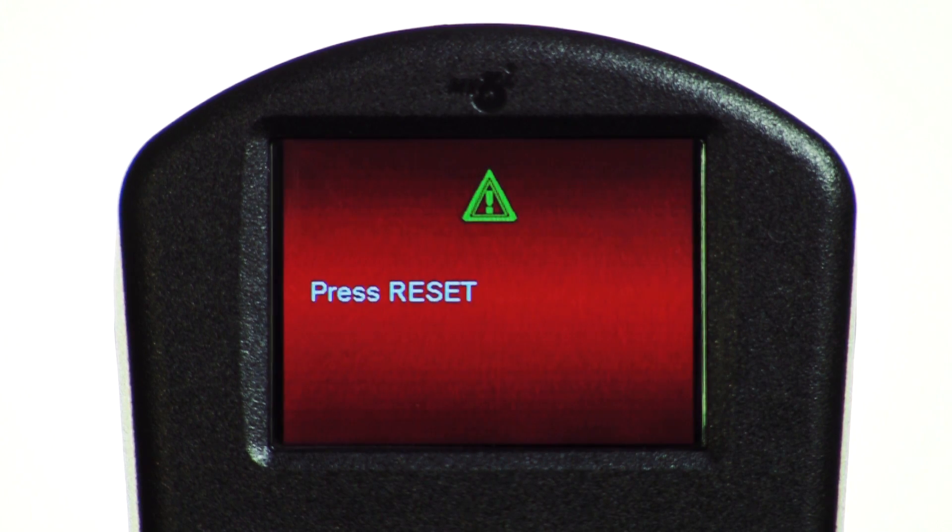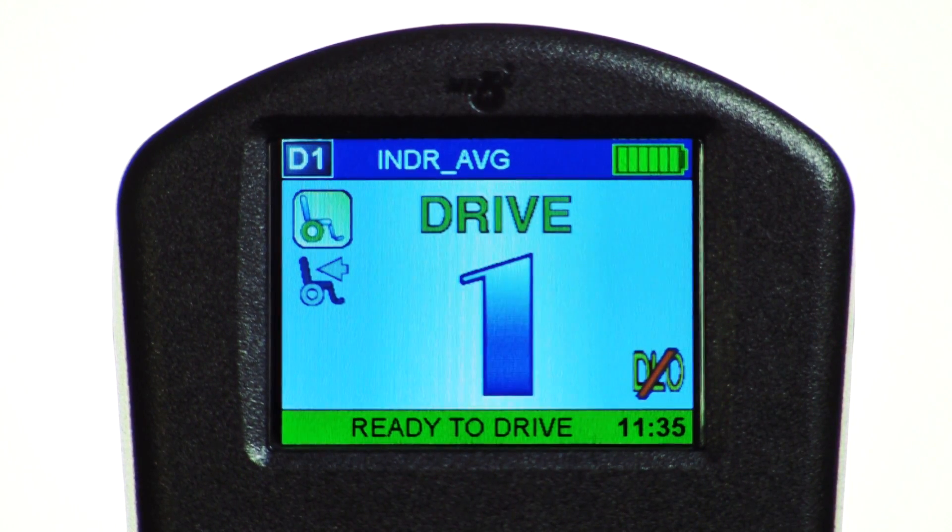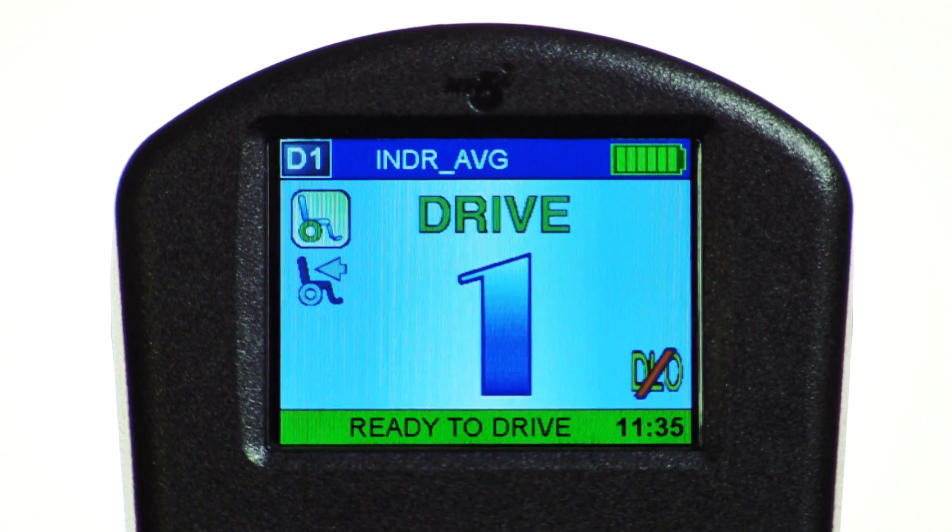InverCare joysticks and displays will turn on with a red warning screen that asks the user to press the reset switch if latched driving is turned on in any of the drives. This is to make certain the switch is in the system.